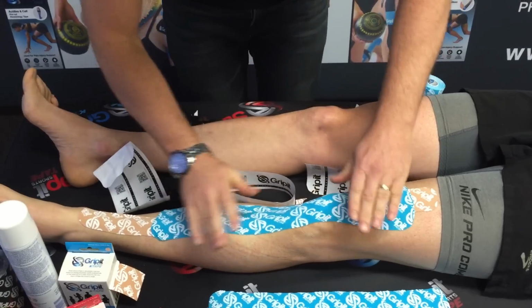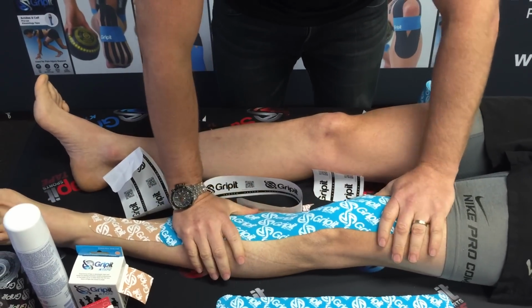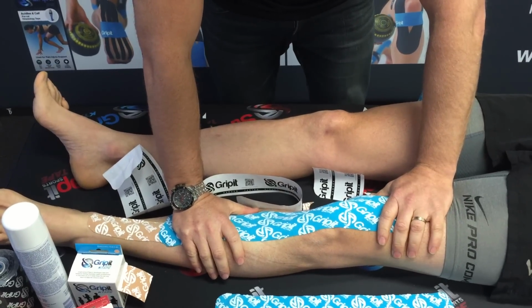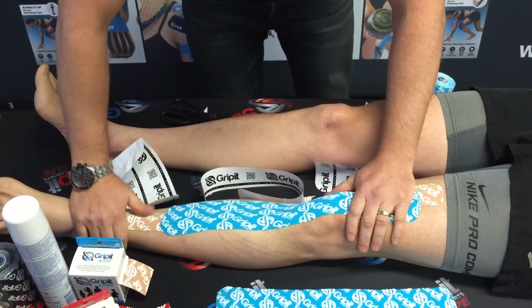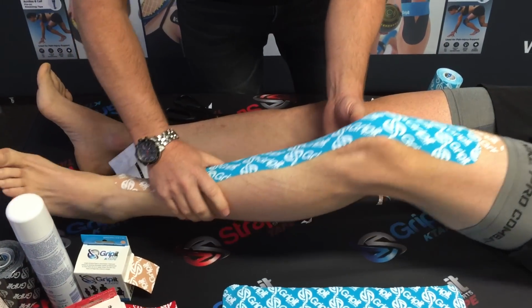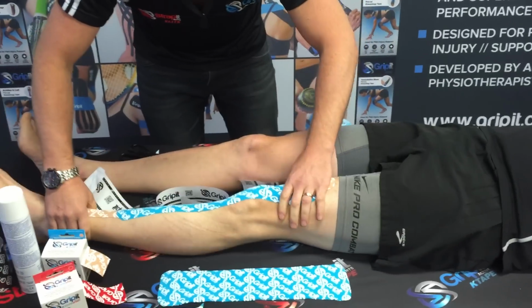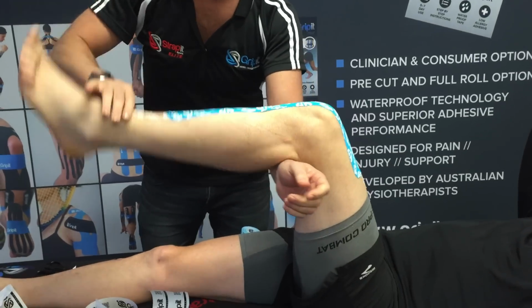And so what you can see there is that we've created this stretch of the tape with the limb in a shortened position, and there's no chance in hell that you can do that with the Gripit kinesiology tape, and that's specific for fascia. We're trying to actually deload the joint. So from that point, I'll get Danny to bend his knee and straighten out again. And so if I just put Danny's leg up here and drop down Danny.